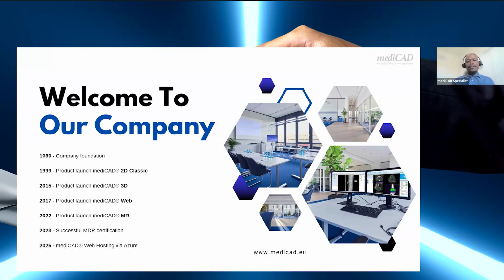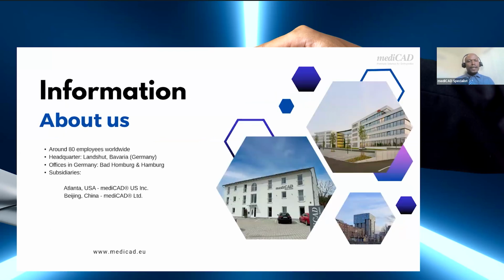It includes software and also a mixed reality headset that you can use in an operating room. It gives you access to the joint and the planning, the CT, and you can record live and so forth. There's a lot of amazing things you can do while you're conducting the operation with the headset on. The company has over 80 employees worldwide. Headquarters is in Germany. We have an office in the US, and also offices in other countries.